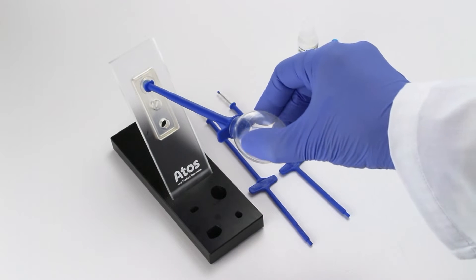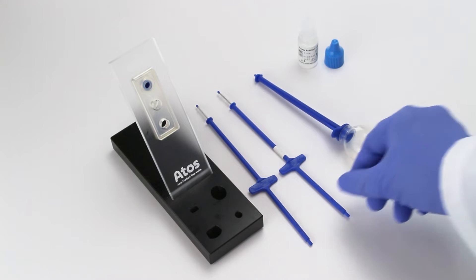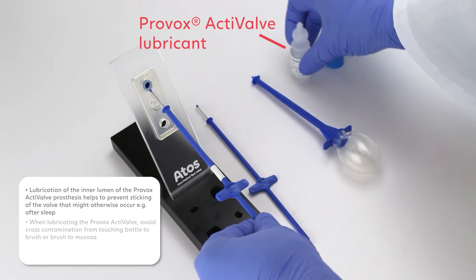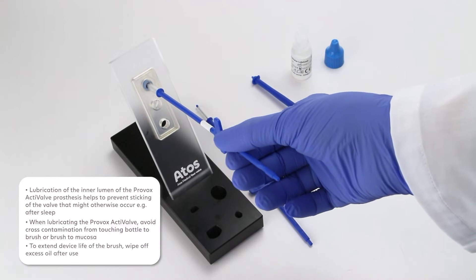After brushing, flush the prosthesis with the Provox flush. After brushing and flushing in the morning, lubricate the inner lumen of the voice prosthesis with one drop of Provox active valve lubricant using the Provox brush dedicated for lubricant use.